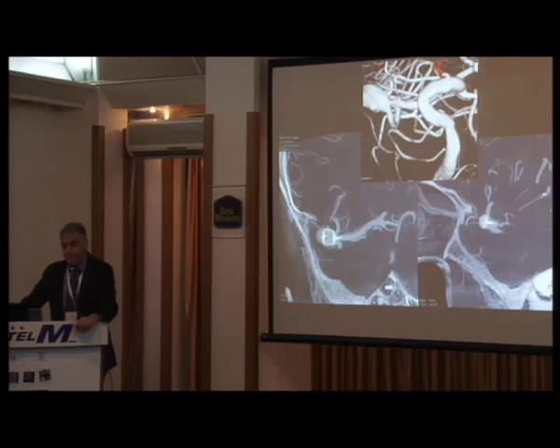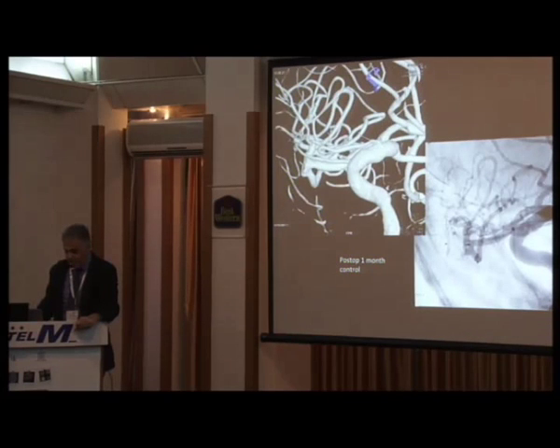Nowadays, people are using the WEB device; I'm not using it, but people are. For the WEB device, intrasaccular flow disruption, very fancy name, you can occlude an aneurysm nicely, and in 1 month follow-up, you can easily see that dog ears are still there. I have a big question mark in my mind about the regrowth rates in that group.